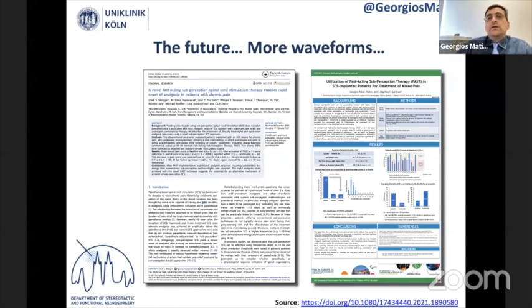The newest thing that we have is the fast acting subperception therapy, a waveform, subperception, 90 Hertz frequency without any tingling sensation. And the good thing here is that the pain relief comes within seconds or minutes when it works. And let me take you one step further. It seems that the newer waveforms can partially help patients with mixed pain, patients with a combination of neuropathic and nociceptive pain. This poster was presented at the European Federation of Pain Congress in Dublin this year, showing that people with a mixed pain syndrome could benefit from this waveform.